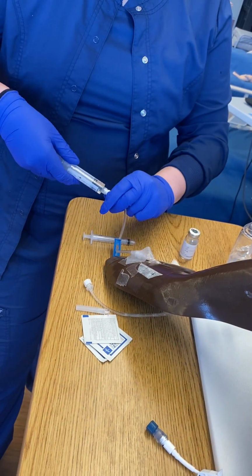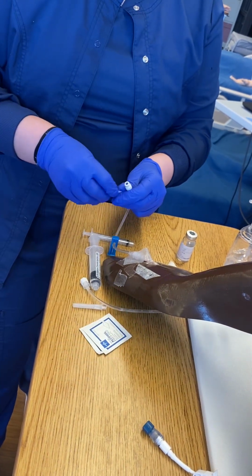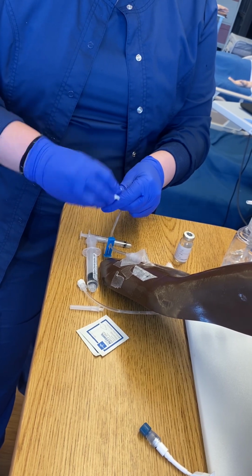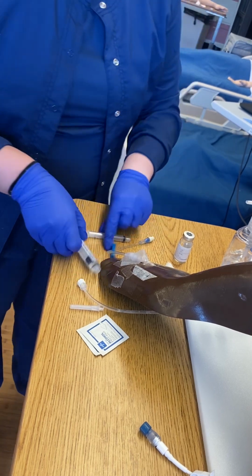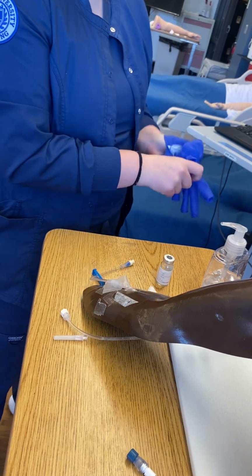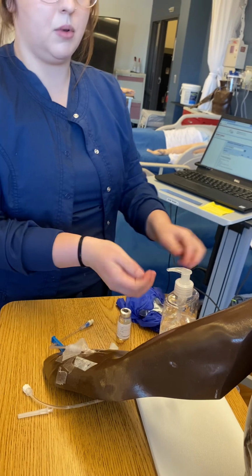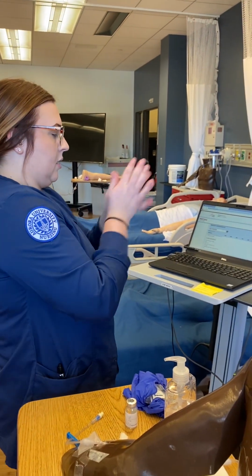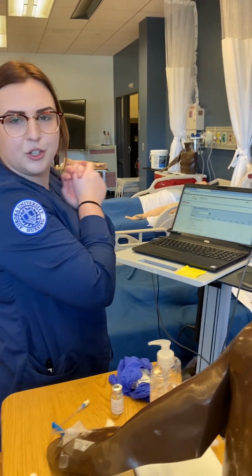And then once I do it for the full minute, take that off, and I would disinfect one last time to make sure that all the medication is off the end of this hub. Perfect. Clean up my mess, take this all with me. And then I would check in with Red to make sure that he's comfortable, and that he's, again, not having any type of reaction. Hand hygiene, and then document that I finished giving the IV push.